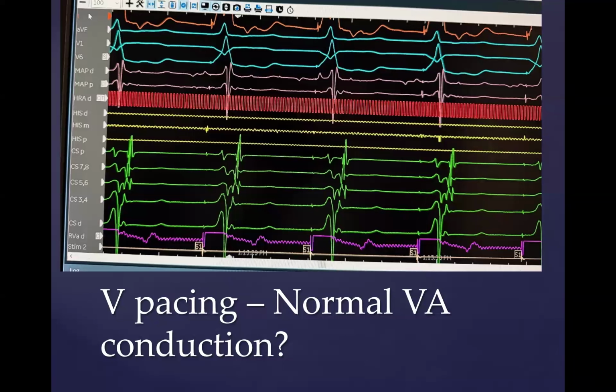You really have to map the entire annulus, whereas on the left side, the coronary sinus extends around about 2/3 of the annulus, and it's wonderful. As Dr. Walsh used to say, it's God's gift to the electrophysiologist because it allows you to really precisely put the catheter and tells you where you're going to be, whereas on the right side, we don't have that.